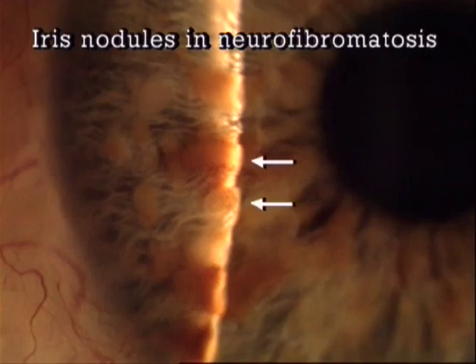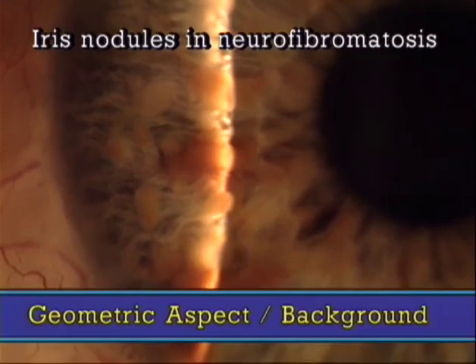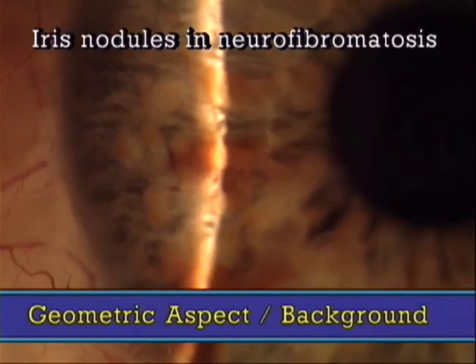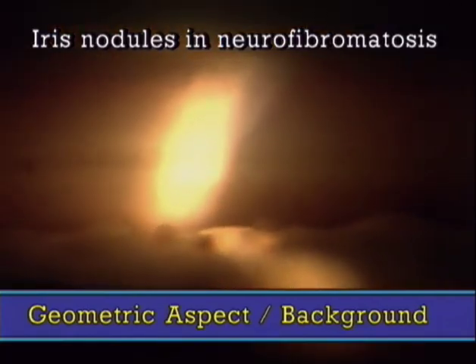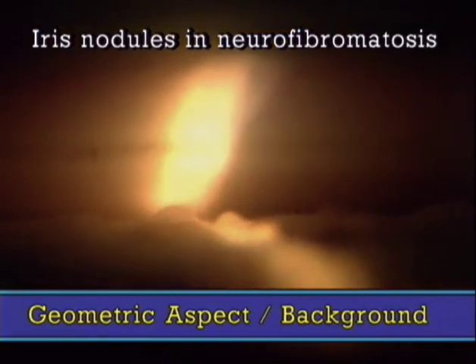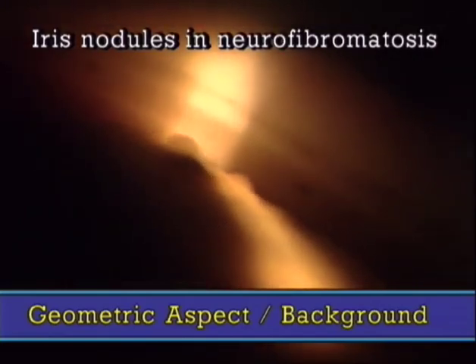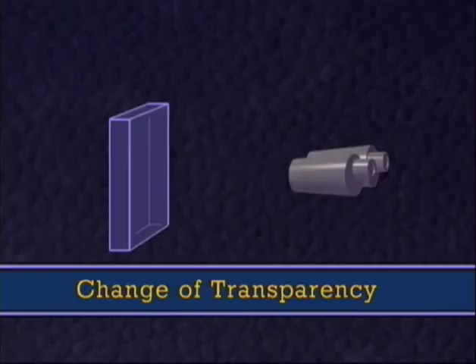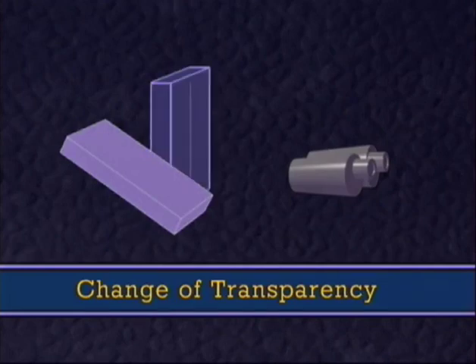Let us look at the iris nodules in a case of von Recklinghausen's disease. The geometric aspect and the background will change when the iris is examined through a mirror contact glass and thus be observed nearly parallel to its surface. Now the globular shape of the nodules can be easily recognized, and when the nodules are observed against scleral backlight, their milky transparency becomes apparent. But changing the observation angle not only changes the geometric aspect, it also changes the transparency of the tissue, which, seen at one angle, may appear nearly opaque, but at another angle, transparent.